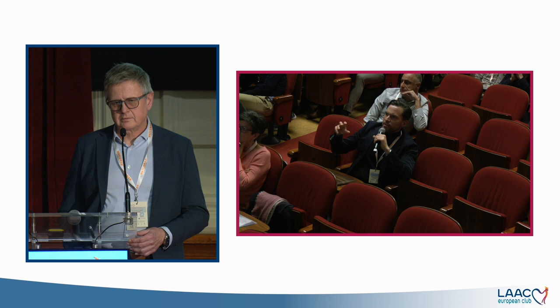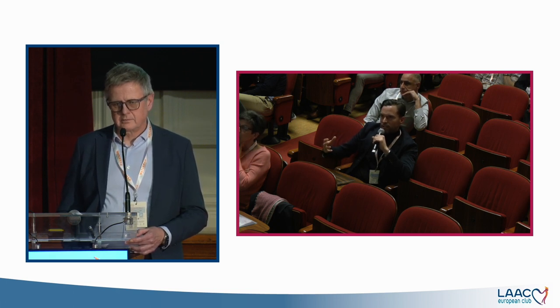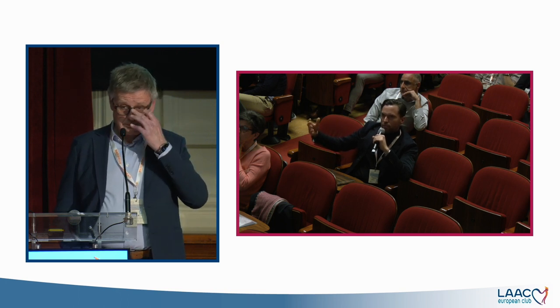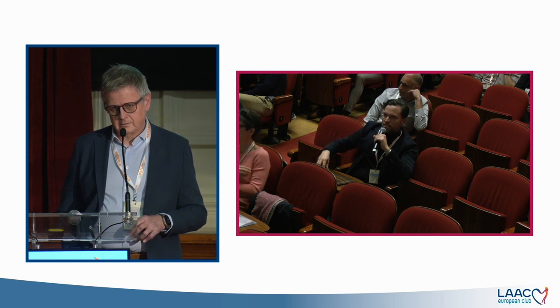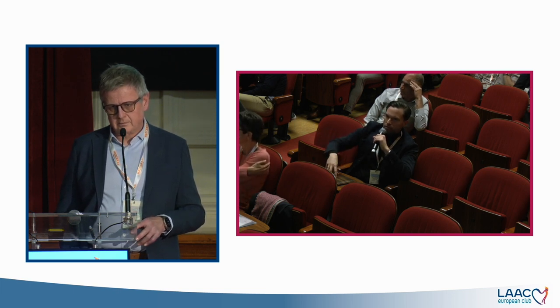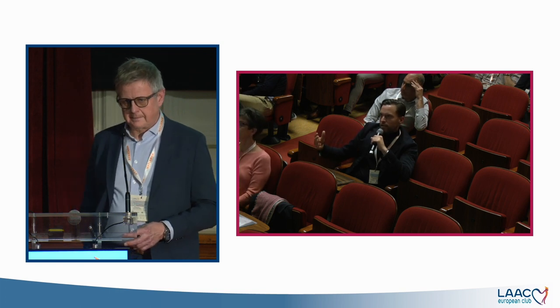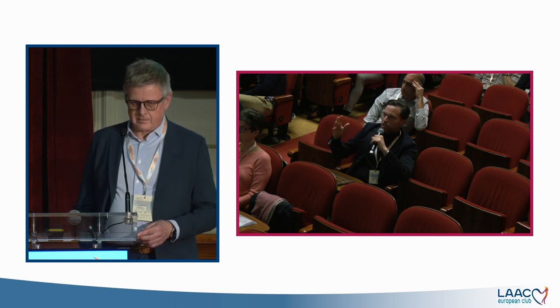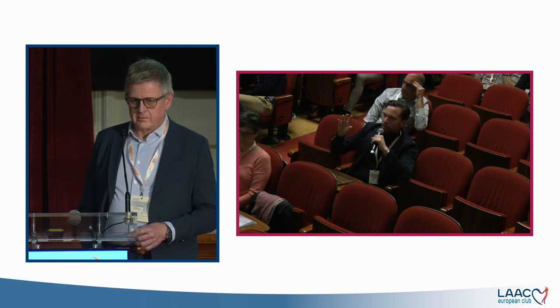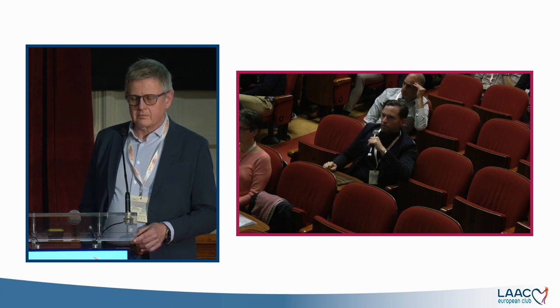And there are parameters predicting serious acute complications like pericardial effusion, and long-term complications like DRT or relevant leakages, that will not have an impact on the acute implant, but should have an impact on the patient follow-up. So this would be my only advice, to stratify it a little bit more, but I think it's really very good what you have done there.